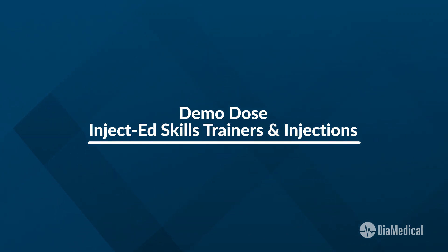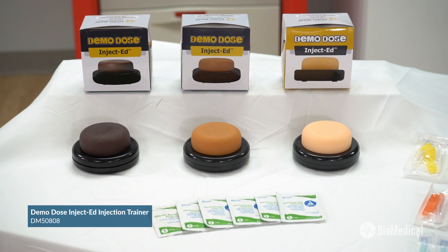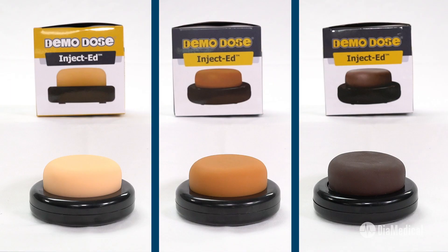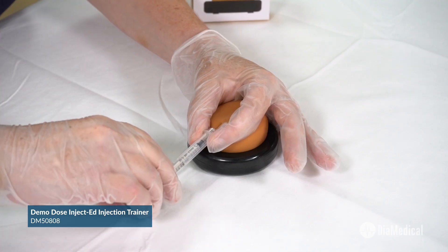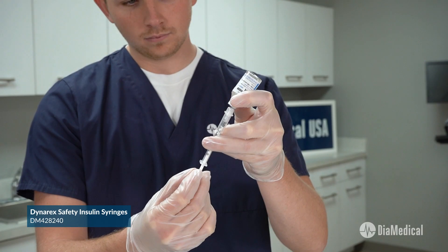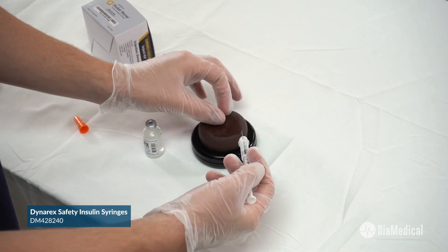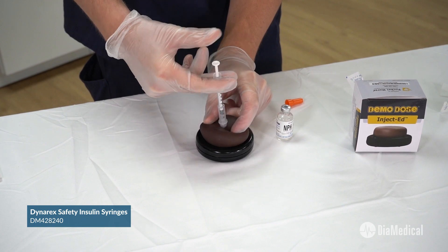The Demo-Dose Inject-Ed Injection Skills Trainer is a great economical option for educators. The lifelike skin surface comes in three different skin tones and is ideally designed for intradermal injection training. A wheal immediately appears when the skill is performed correctly, and it even dissolves after a few seconds with no lasting marks. The underlying foam pad feels just like subcutaneous tissue for insulin and heparin injections. Fluid or air can be safely injected without damaging the foam.